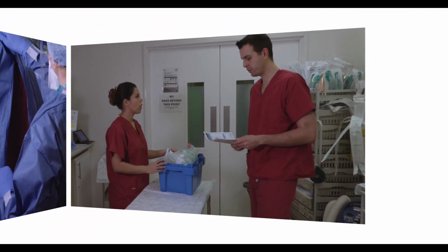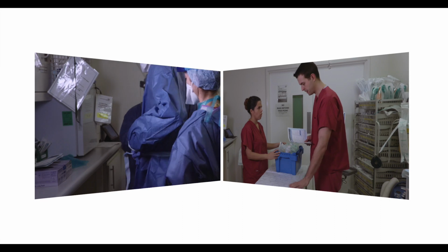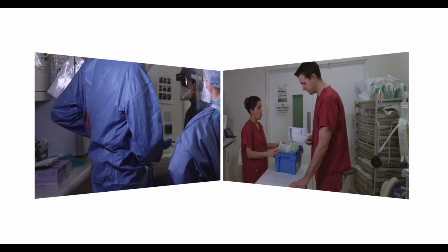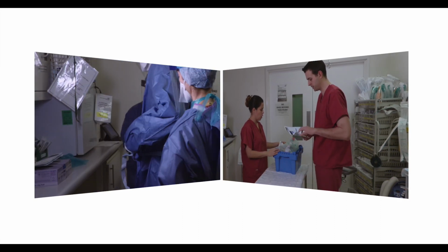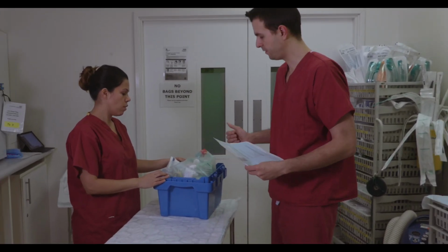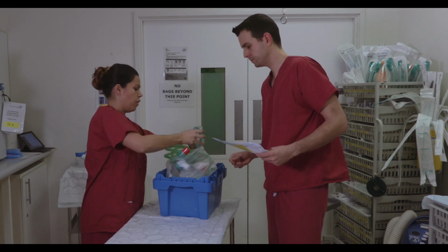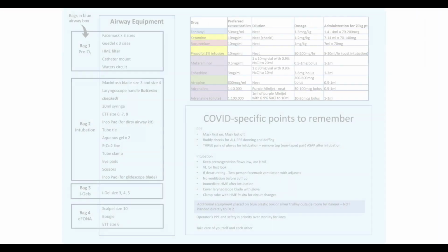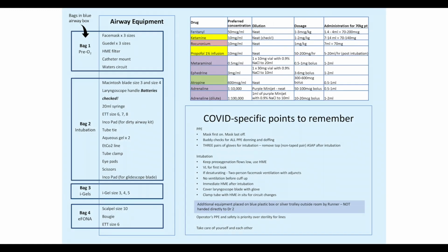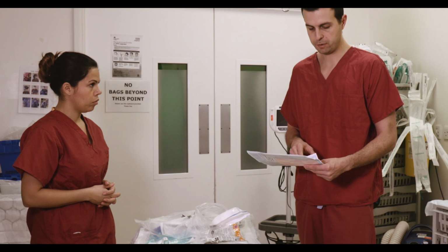2. Prepare equipment. Consider allocating 2 team members to check airway equipment whilst the other 2 members start donning PPE. Assemble airway equipment using a call and response method with closed loop communication. Get a face mask. Face mask. Okay. Please refer to the full airway equipment list from the guideline. We need to also get our video laryngoscope.